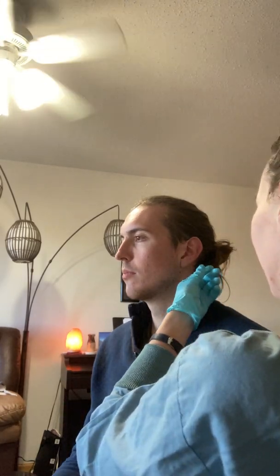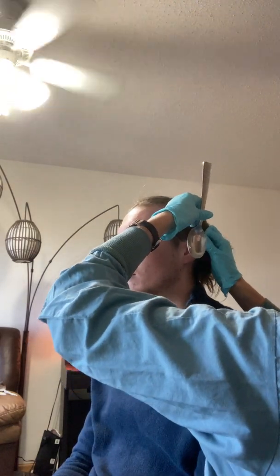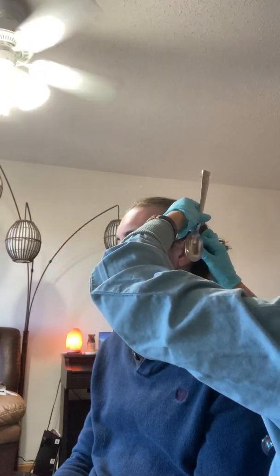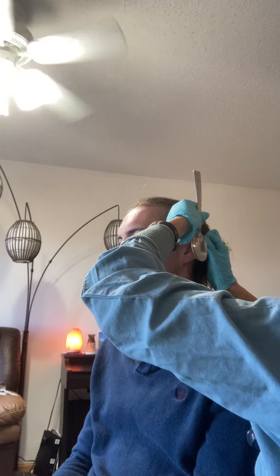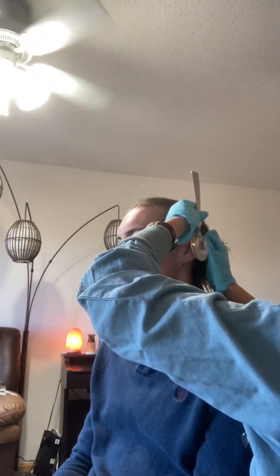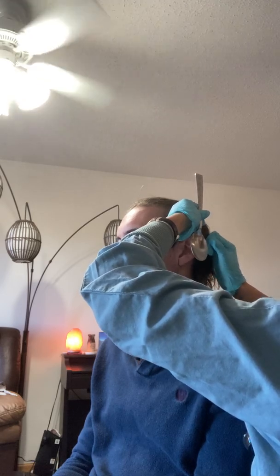Now to the other side. So starting with that external auditory meatus, looking at the external canal, noting that there's no bumps, lesions, redness, bruising in there. Your tympanic membrane is a pearly gray in color. The cone of light is in the anterior inferior side, and it looks good.